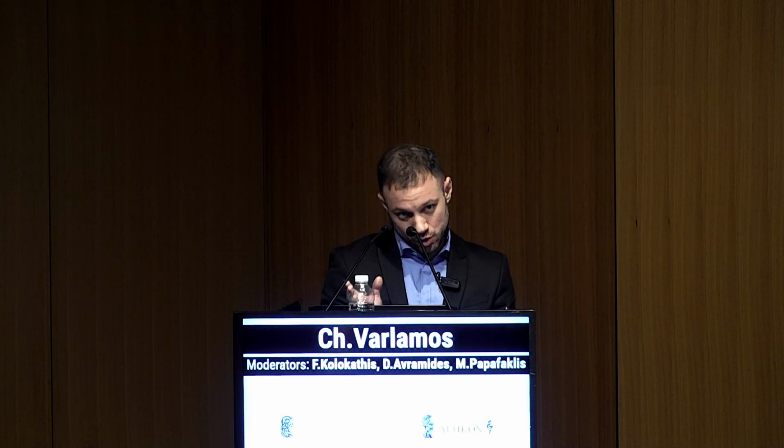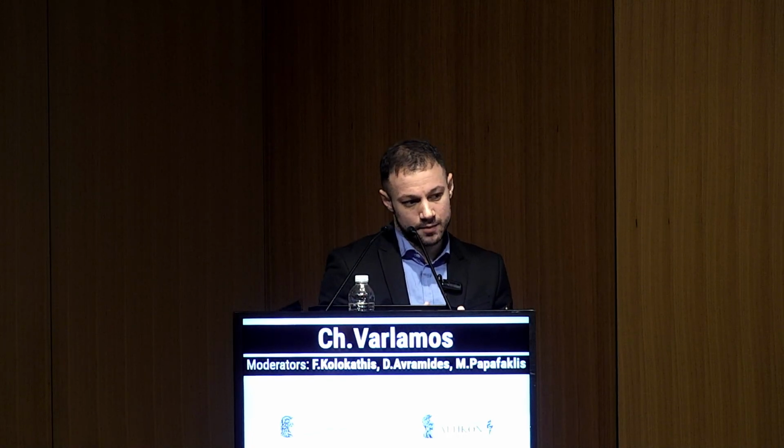First of all, thank you for your comment. Of course, I have to admit, I didn't do IVUS when I pre-dilatated and after. So I did IVUS pre and post. I was dedicated to put a stent exactly at the ostium. That was my planning. But I accept, of course, different operators would do different things. I understand exactly what you are talking about. To have a good result with pre-dilatation or DCB there in the ostium, avoid it and landing it after. It would be an option. I didn't go for it, okay?